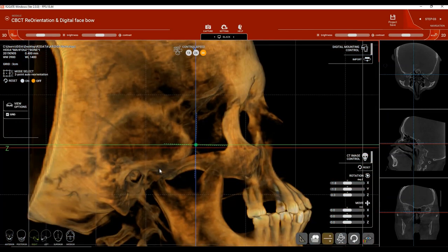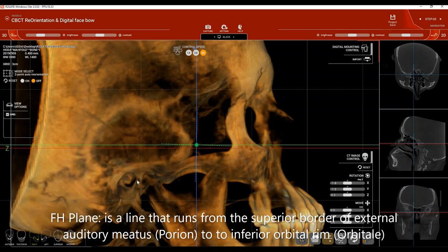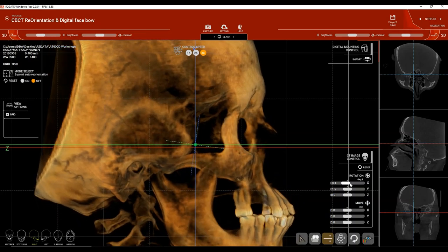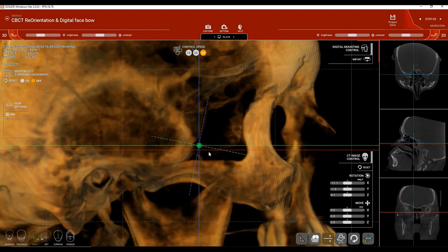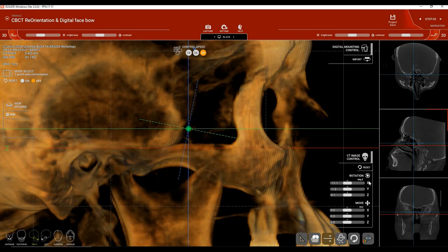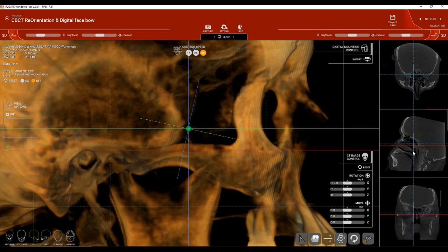From a side view, the last step is establishing Frankfurt Horizontal Plane — a virtual line running through the superior border of the porion (the external auditory meatus) to the inferior border of the orbit. Use Rotation X to align both structures on the same line. Move the red line to double-check that both the porion and inferior orbital rim are on the same line, making small additional rotations as needed to confirm both structures are correctly aligned.